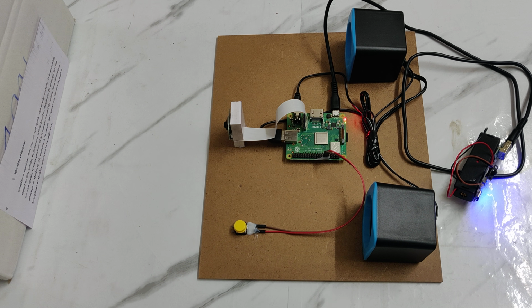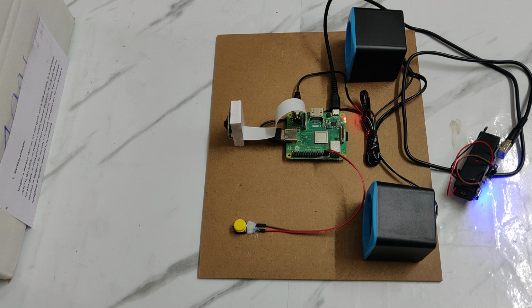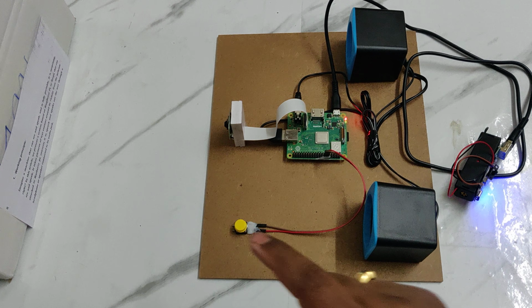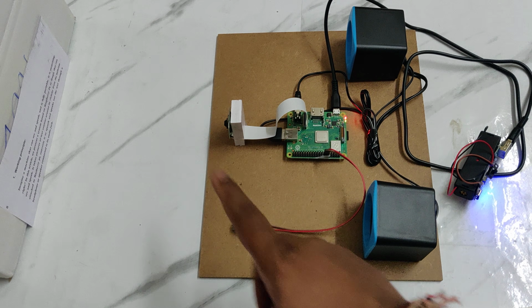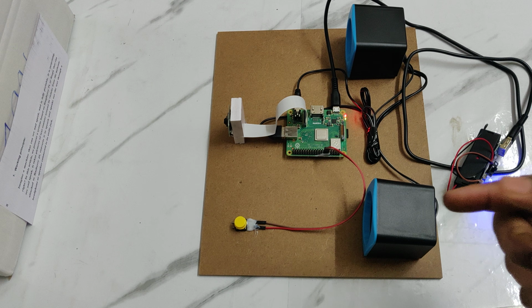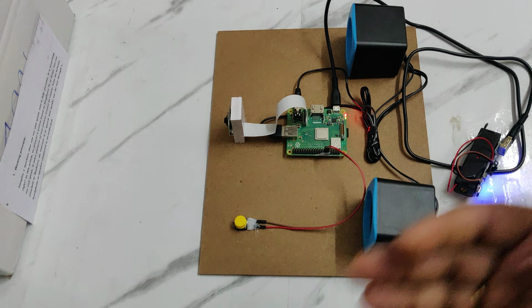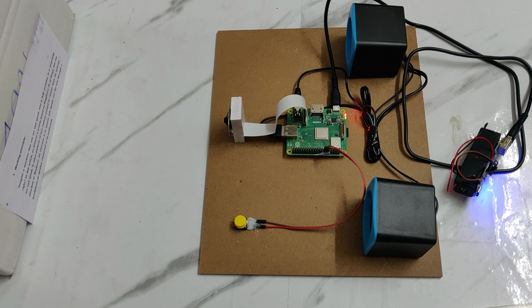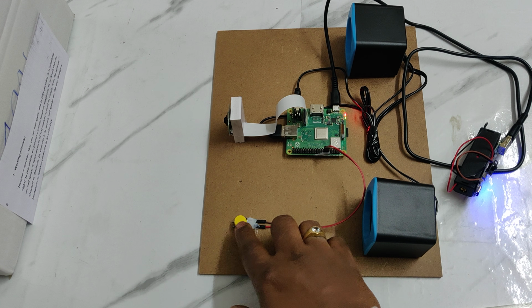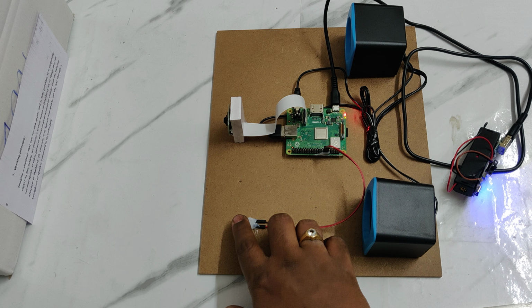Once the welcome message is announced, we can press and release the switch. In this model we have added a feature so that once you press and release, the system will announce capturing the image, processing it, and extracting the text. Like that, it is announced stage by stage. Based on the text size, the smart text book reader takes time for extraction. Just press and release that.